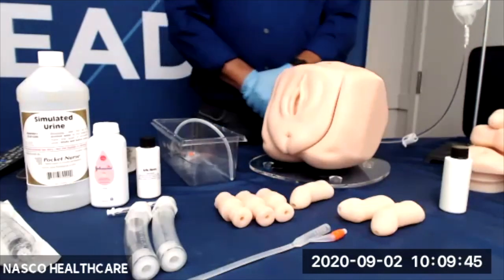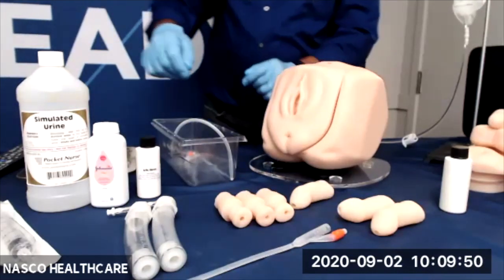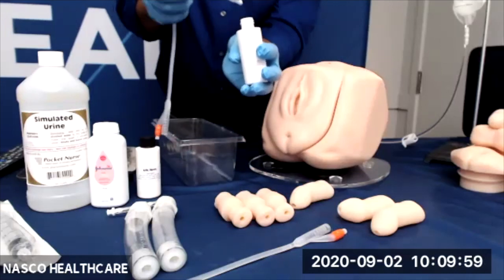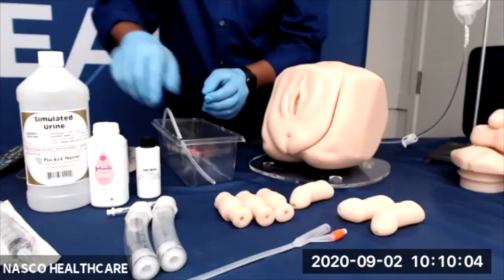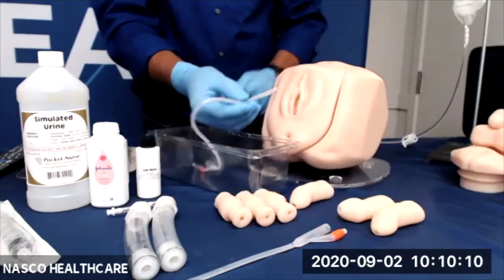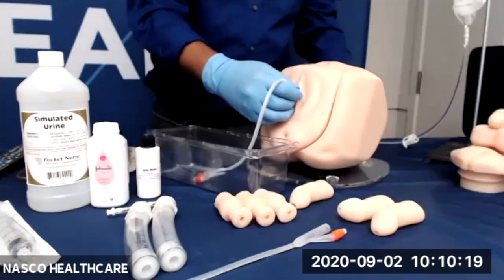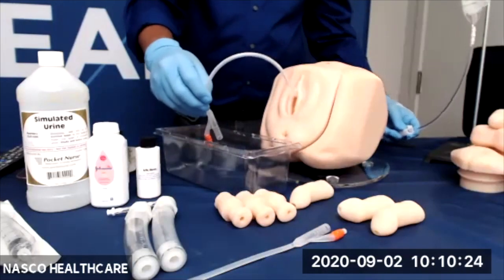Next, let's move on to the urinary catheterization. For this step, we will need to lubricate the catheter and the urethra each time a catheterization procedure is attempted. Khaled will lubricate using the supplied lubricant, and this will minimize the damage to the urethral wall of the simulator. It is very important that you only use the supplied simulator lubricant — make no other substitutions, such as water-soluble lubricant like KY Jelly, as they tend to build up in the urethra over time.